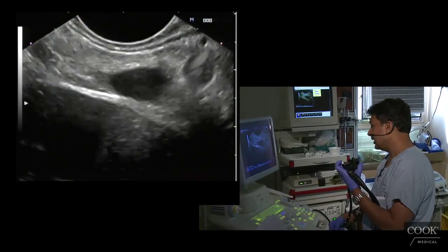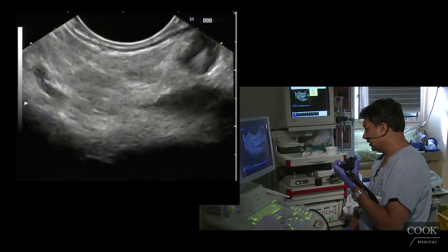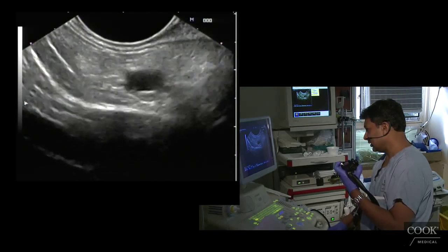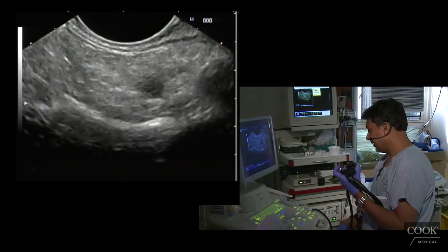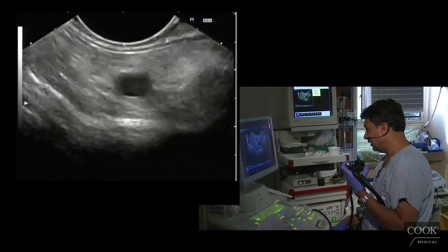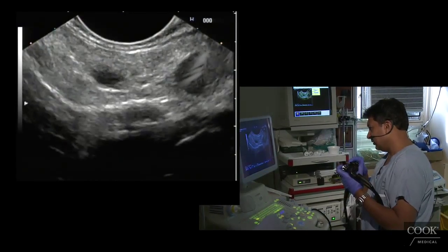See, the thing about it is if it's a malignancy, there's a risk of tumor seeding in the gastric wall. So that's why I'm going to talk to the surgeon and say, look, if you really want me to needle it, I'll do it. But, you know, we're looking at a tail resection. He's a pretty healthy guy. Even though it's asymptomatic, I think they should just take this out.